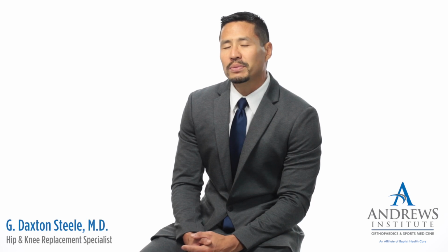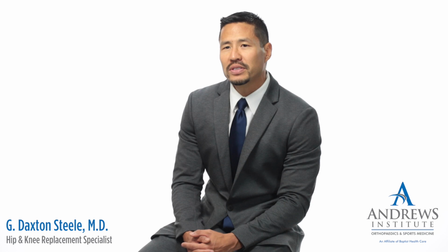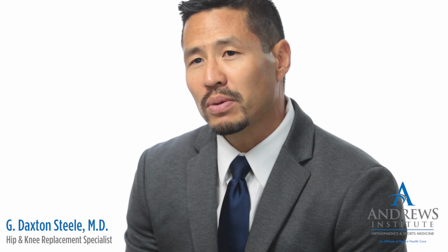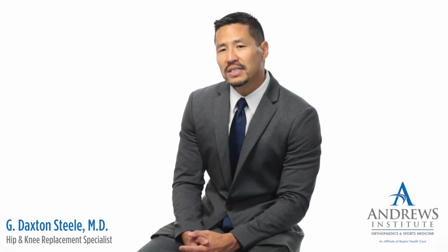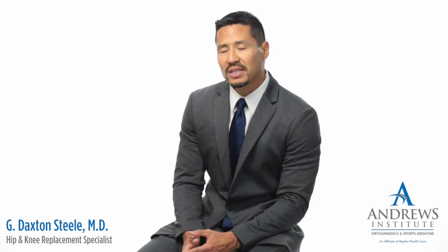So a partial knee replacement is replacing one compartment within the knee. There are three basic compartments. There's the medial, the lateral, and the patellofemoral. The most common replacement we do is the medial knee replacement, which makes up about 90 to 95% of partial knee replacements. And instead of replacing the whole cartilage and bone in the knee, we would just replace the diseased or affected cartilage within that compartment.